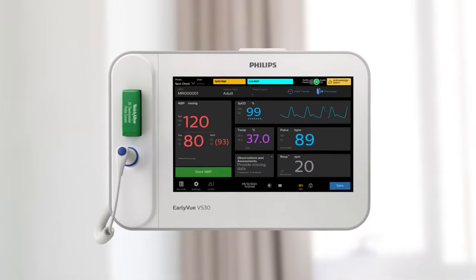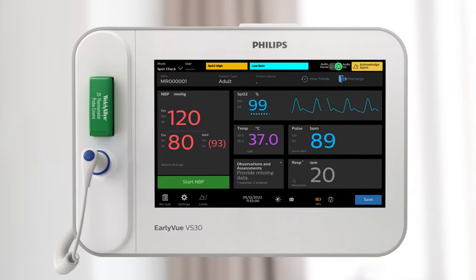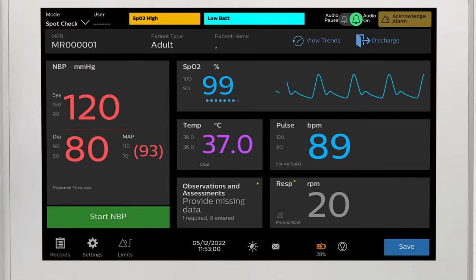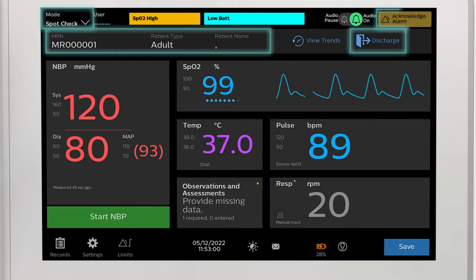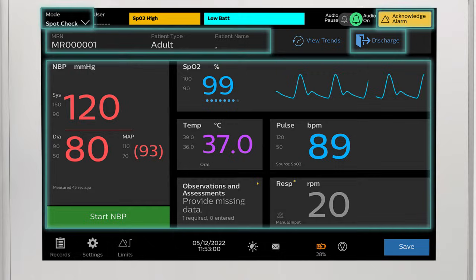The front panel of the VS30 is an interactive touch screen. From the main screen, you can select monitoring mode, view patient information, admit and discharge your patient, acknowledge active alarms, as well as quickly view active measurements.